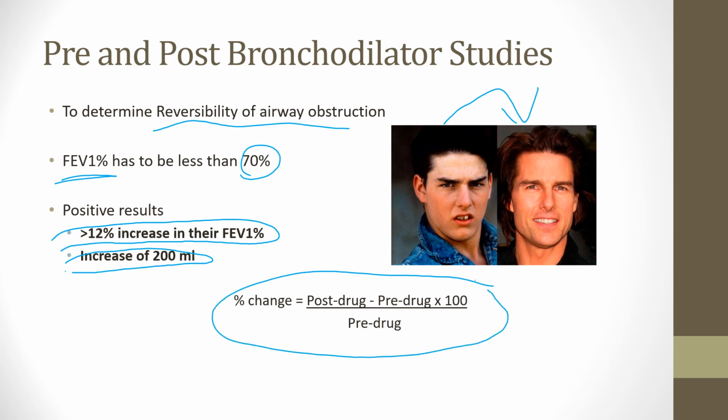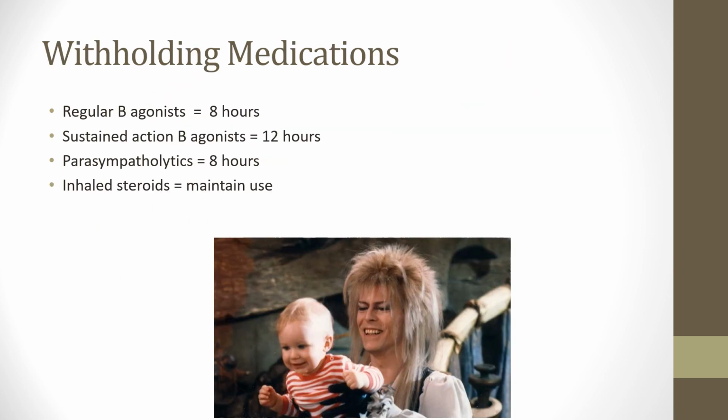I would expect you guys to remember that, and especially that a 12% change in the FEV1 or an increase of 200 mLs would show that someone's reversible, right? Because that's what we're looking at here, is reversibility. Reversibility is there for their reactive airways.